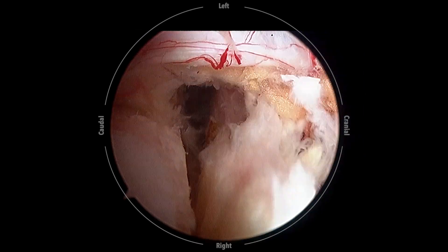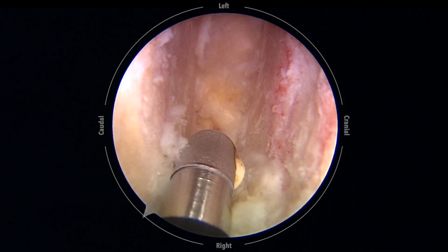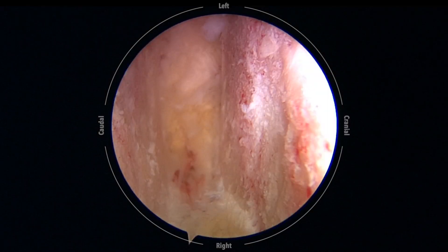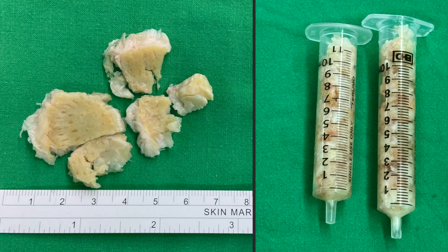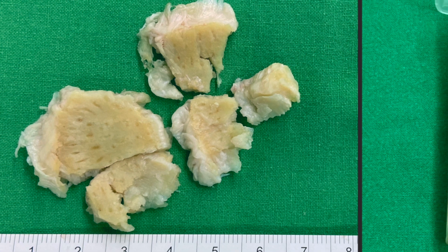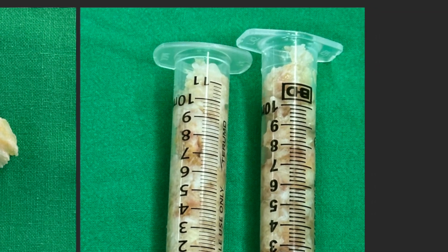After thorough disc space preparation, we place the endoscope into the disc space to check the result. In most cases, the amount of disc removed from a single disc space usually exceeds 10 ml.